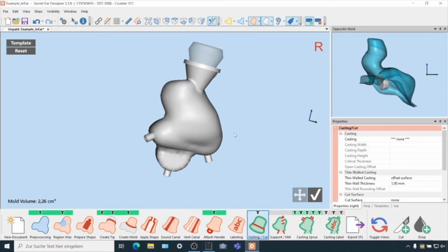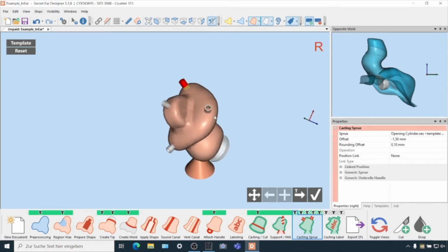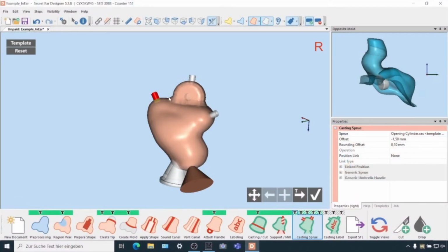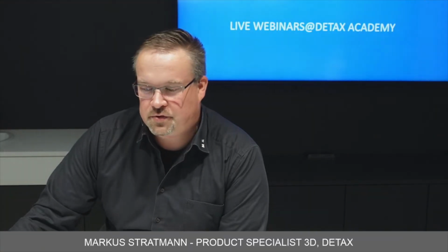So for the Cocoon material, you can see on the right side of the desktop here, we select a wall thickness of 1.0 millimeters. This is, from my point of view, the perfect wall thickness. The next step is to set the cylinder or the casting sprue. For the casting sprue, I need to show you and explain some more things. From my point of view, the modeling guys also need to fill up the silicone in the cast forms, because in this step, how to set the sprue, you need to know how the material goes inside of the cast later. I will show you the process later, and then I will come back to this point.